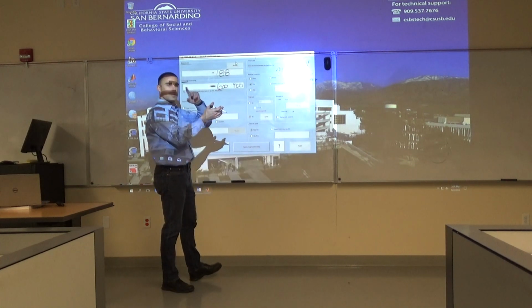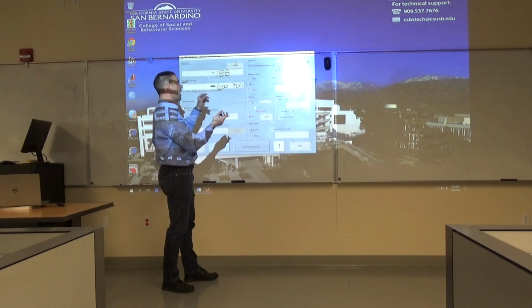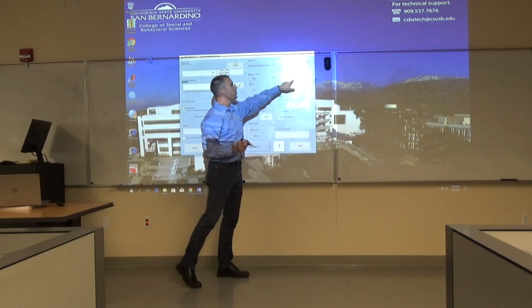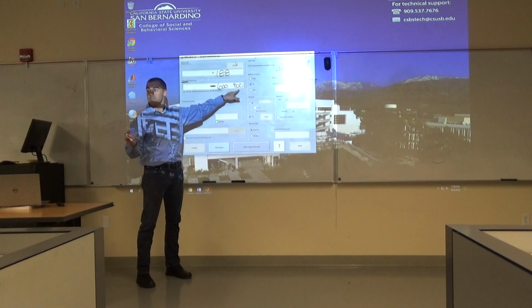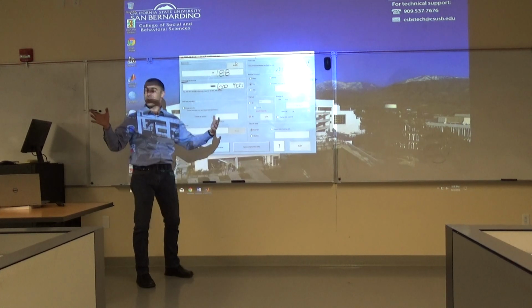So this is, we're clapping our hands saying, servant, bring me some data. Bring me a pretty picture now, right? And it's saying, great, what kind of a measurement do you want? Between two fixed latencies. Well, what are our two fixed latencies? Well, it's between 600 and 900 milliseconds. See where we're going? Okay, so there's actually a method to the madness, right?